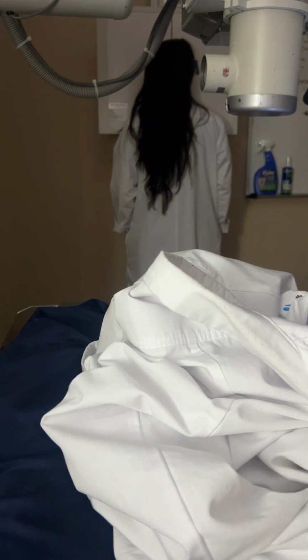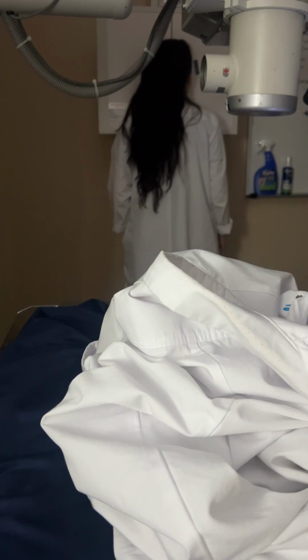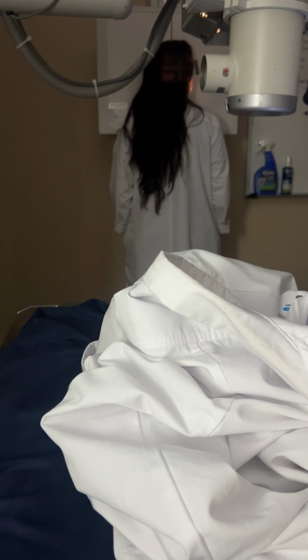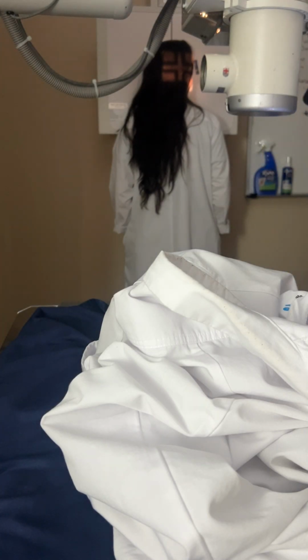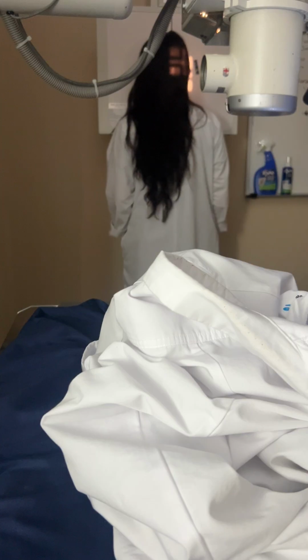And that's for SID as well? Yes. And when this is positioned correctly, the mid-sagittal plane forms a 53-degree angle with the IR, okay? You will do both the right and the left orbit for your midterm, or for your final, okay?